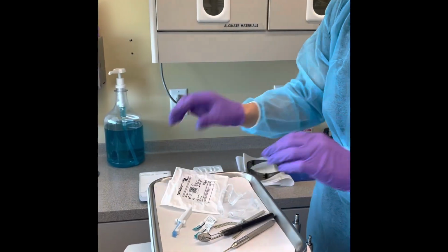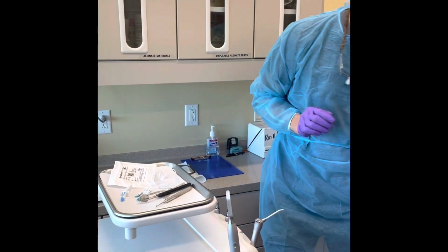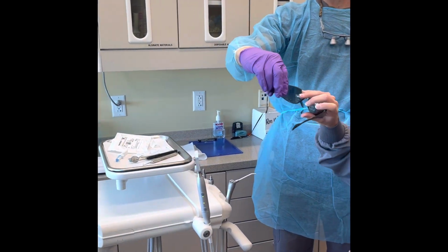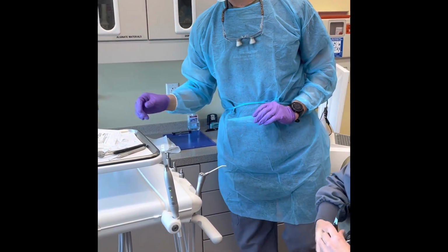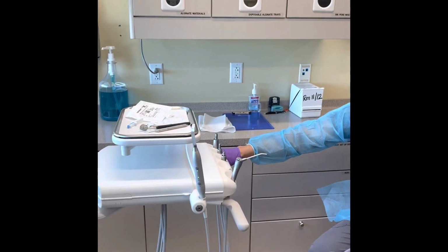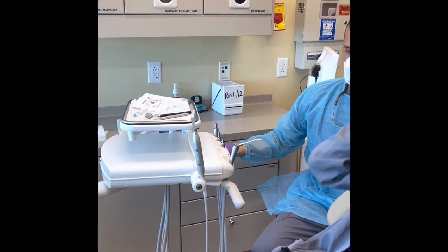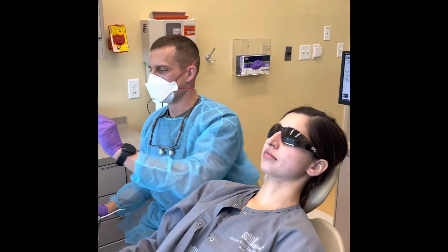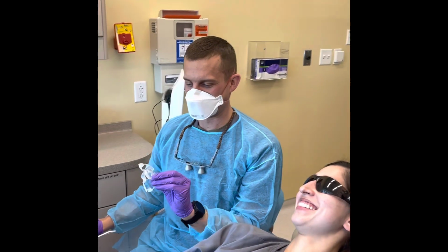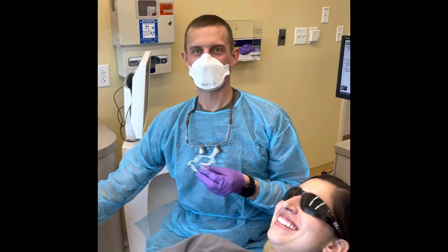All right, perfect. So we're going to go ahead and get started. You can take the mask off, Dr. Dainty. I want to put your glasses on for us. And they are still a little wet from being wiped down, so I apologize. All right. Well, it looks pretty simple to put in. Looks just like a NOLA dry field without the sections, so I think we'll be okay.